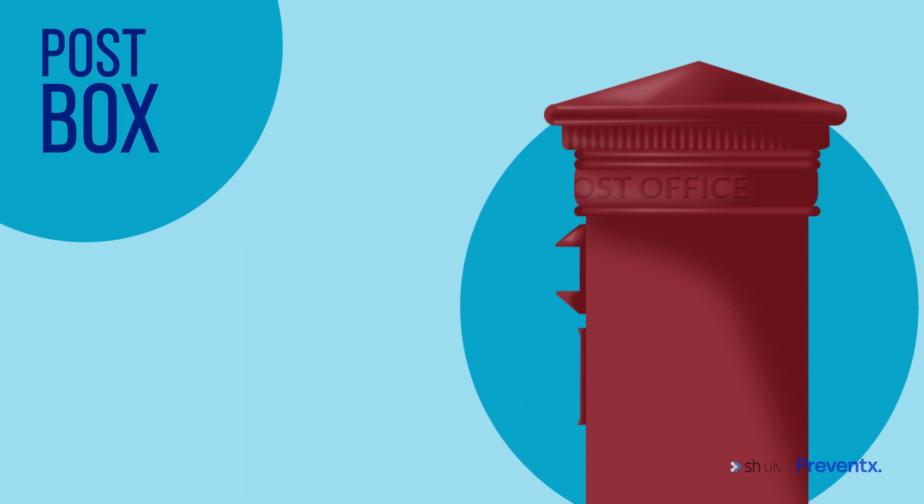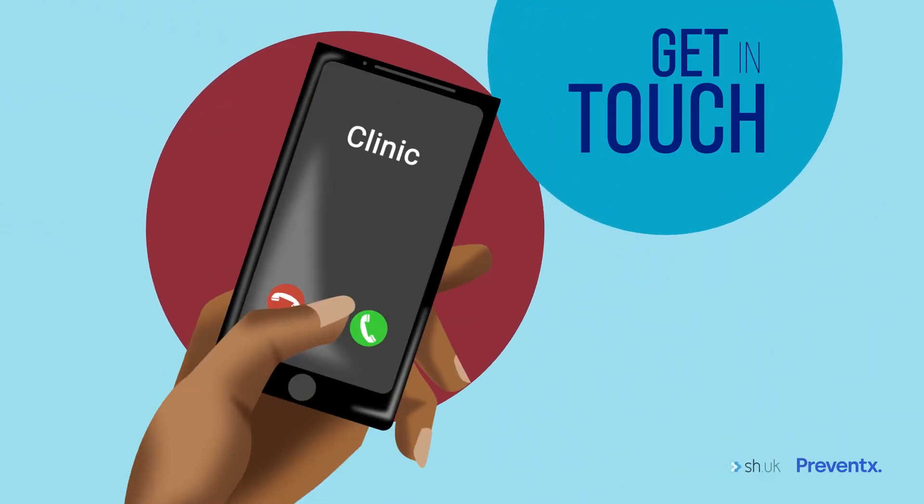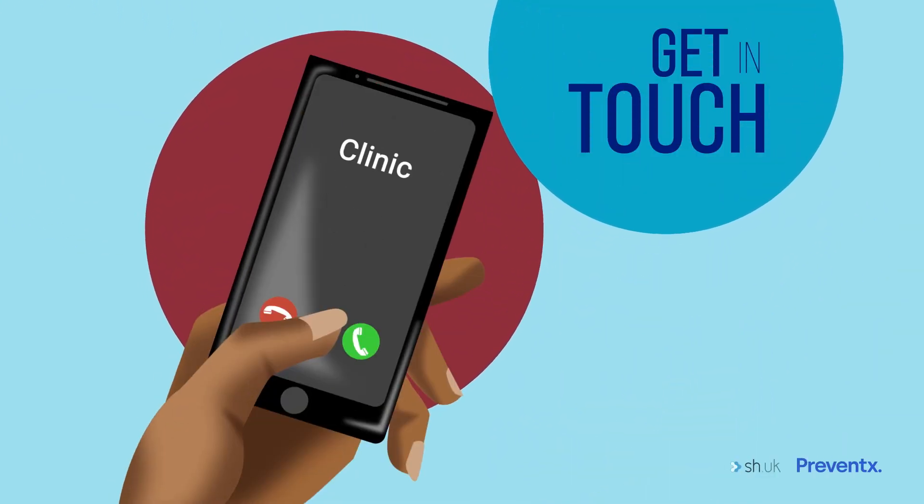If you had problems collecting your sample and you've tried all your lancets, get in touch with us or consider going to a local clinic. If you have any questions, get in touch with us.